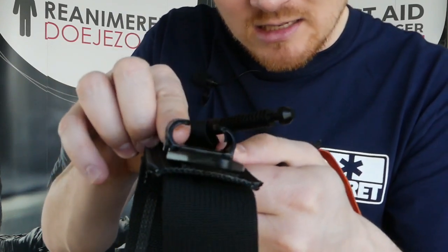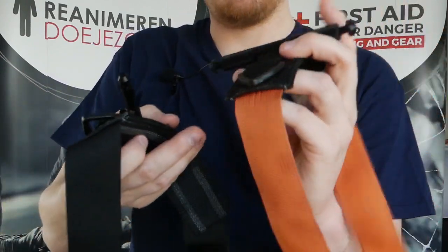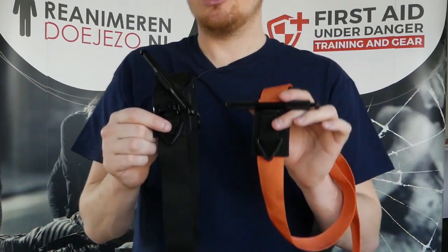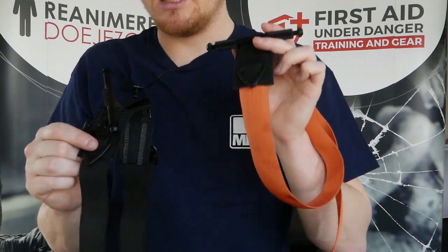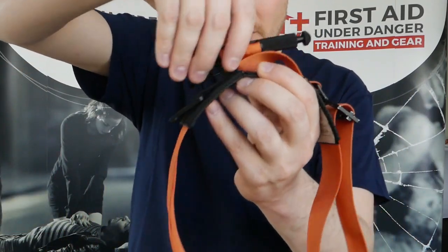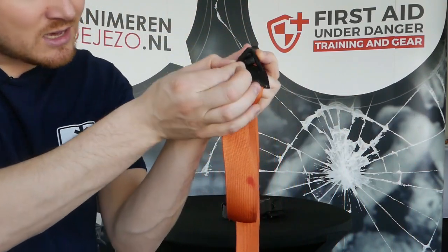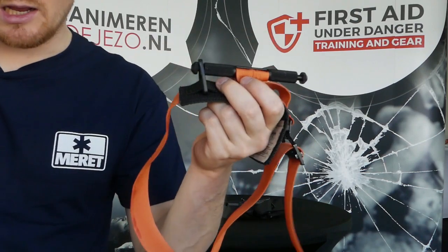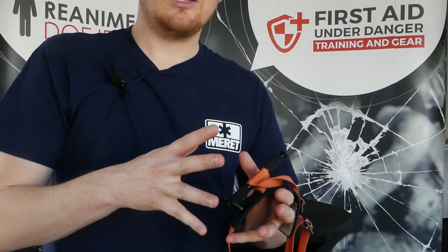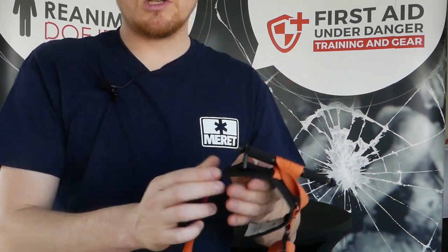and that is the secure buckle where you can buckle it up, as you can see on the Generation 3, there was none. There was no way to do that. So for self-application, the soft tourniquet wasn't really great because of that problem. Because if we take a look at the Generation 3, the problem was if you have all of the pressure on your tourniquet rod, you needed to be able to get this little triangle and get your tourniquet rod inside that triangle. And that is very, very hard to do in a situation where you already have stress, you already are maybe in a little bit of shock because you're losing blood. So that wasn't the best solution.